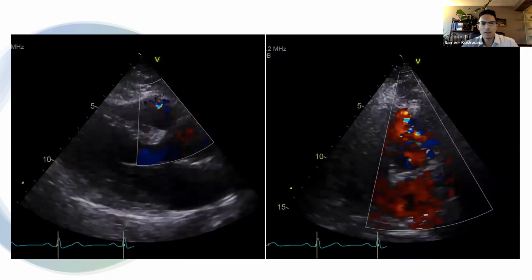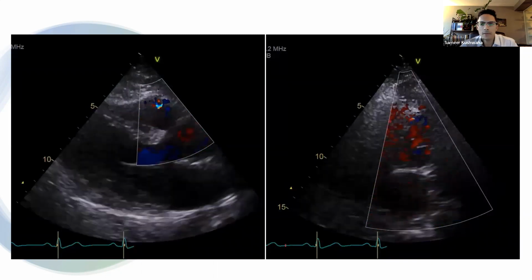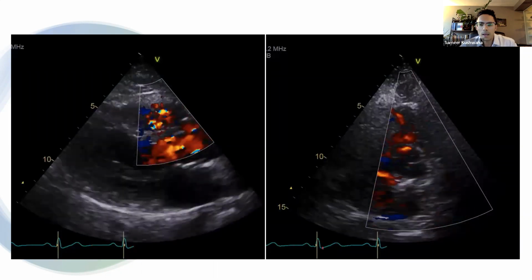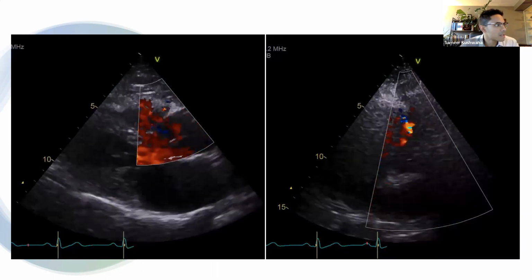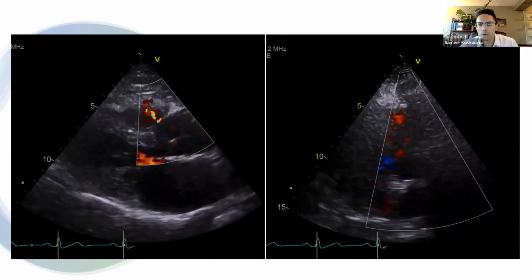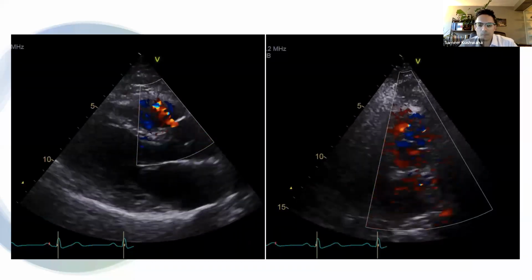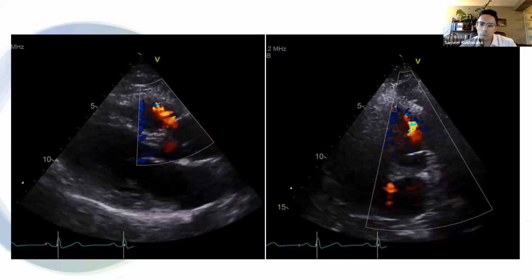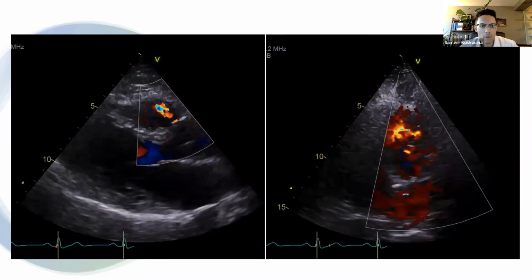So this is a different patient than I showed before. This is a parasternal long axis on the left with a parasternal short axis on the right, and it shows color flow going from the sinus of Valsalva into the right ventricular outflow tract. And this is diagnostic of a rupture of the sinus of Valsalva into the RV. We can see that the flow is highest in diastole when the aortic valve is closed and when there's no forward flow, when you would sort of expect the blood to be filling into the coronaries as well.